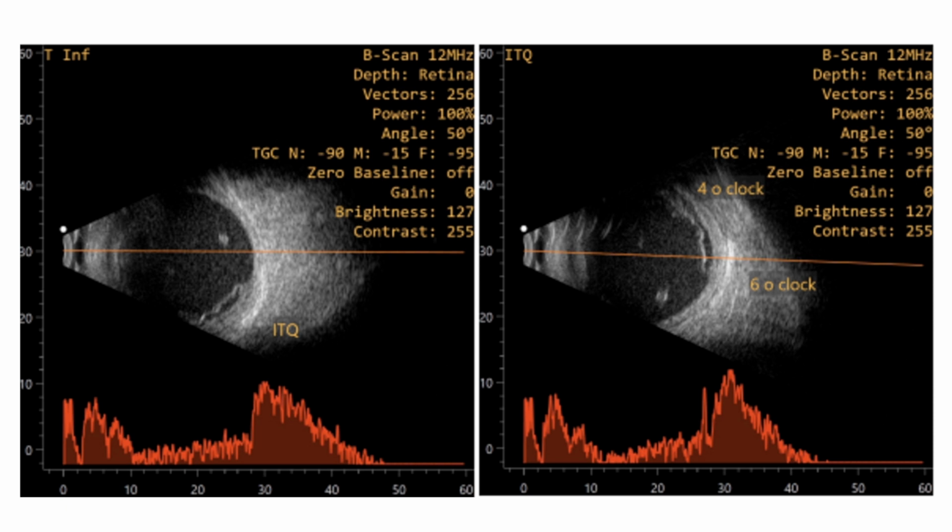What is this corrugated membrane that you see? What exactly is that membrane which you have shown in both scans? It appears to be retinal detachment focally in the inferotemporal quadrant.